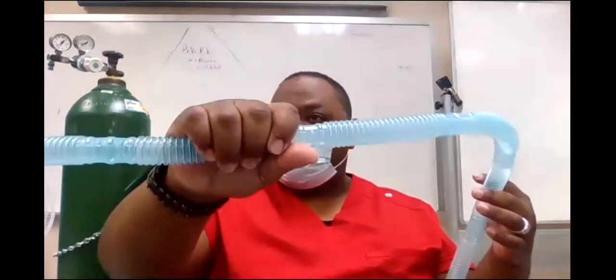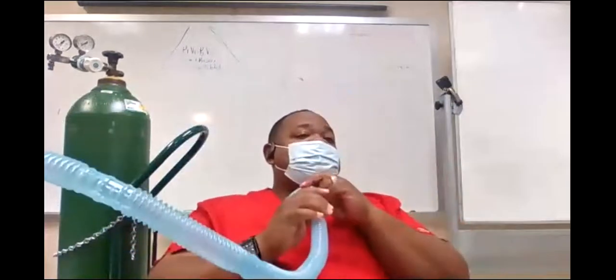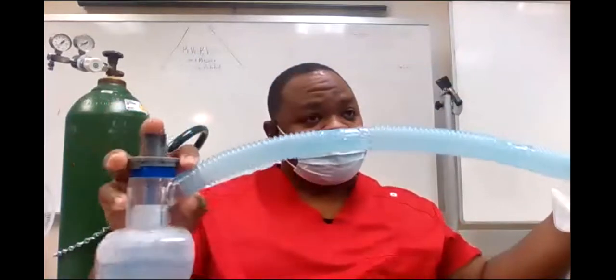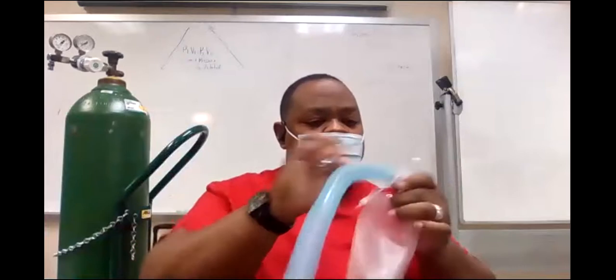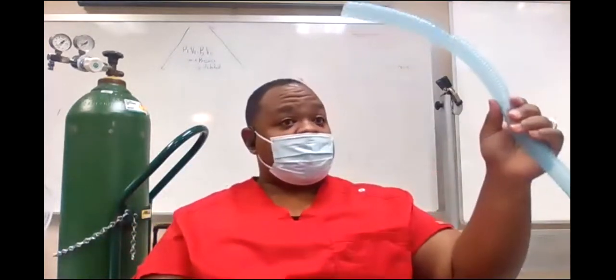because it's either going to get cold, the patient's room might be cold, right? And it's coming together and they coalesce. So you don't want that water to go down in his trach, so you have to have what's called a water trap or water bag after the first large bore tubing. Okay, so you have the large volume nebulizer, you put one large bore tubing on here, and then your water bag. And then your second what? Large bore tubing, right?